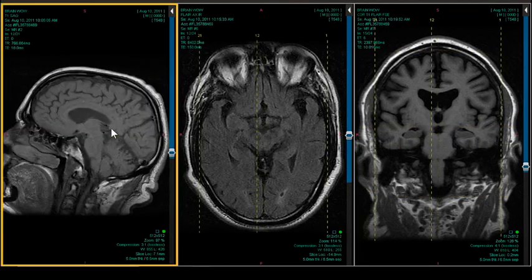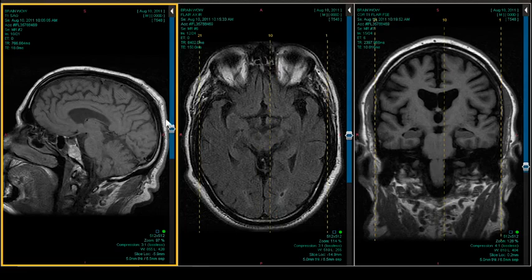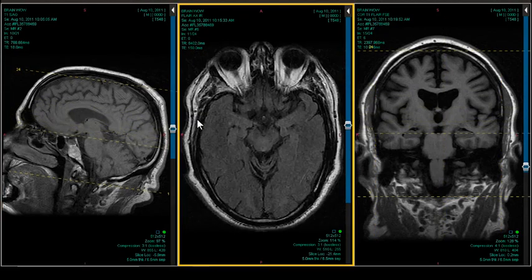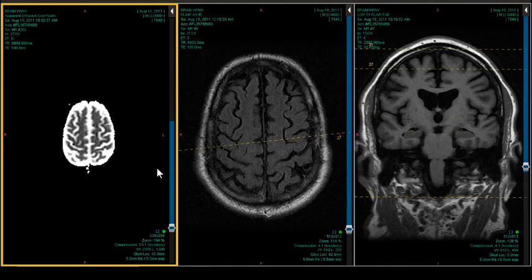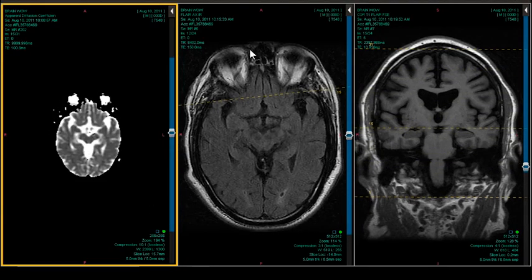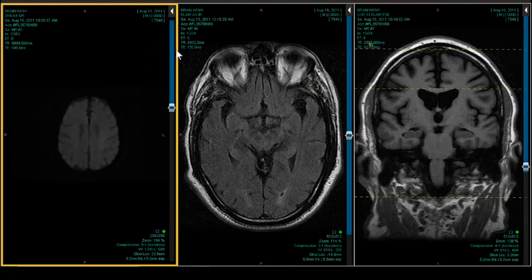And I've got my sagittal T1, and I'm just going to scroll around a little bit while you guys are getting oriented. And I'm going to pull down my diffusion image just to see if there's any diffusion restriction. It's actually my ADC map. I apologize. There is a diffusion image right here, the black one. It's the third one in.